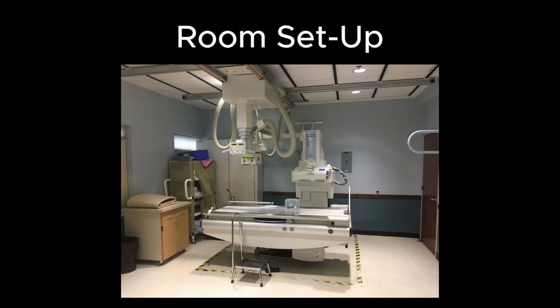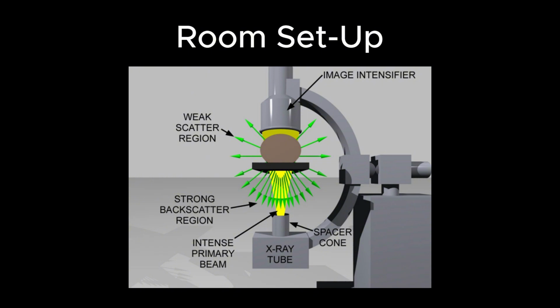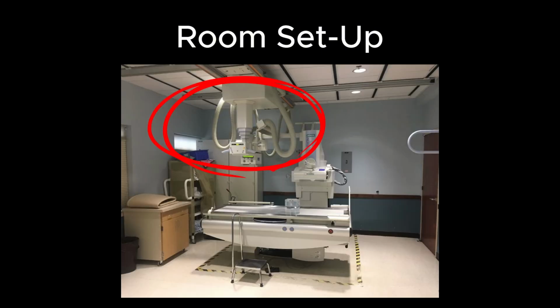Alright, and so now we're going to talk about the setup of rooms. So in most modern fluoroscopy rooms, the X-ray tube is placed under the patient, and the image intensifier is positioned above them. This under-over configuration minimizes the scatter radiation toward the operator. Some fluoro rooms also included a second X-ray tube used for spot films, which are static, higher resolution still images taken during or after a procedure.